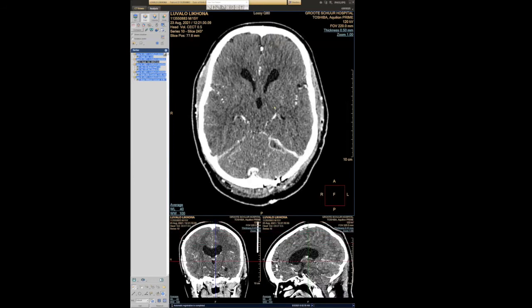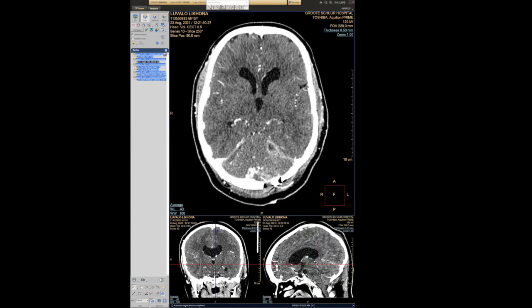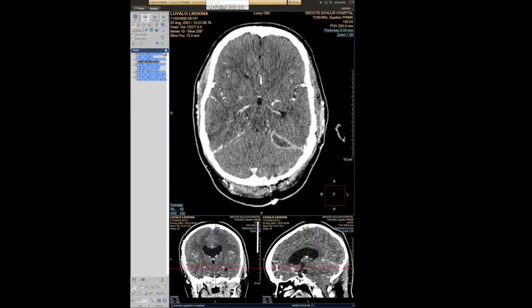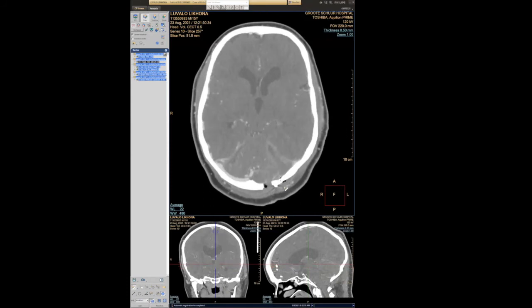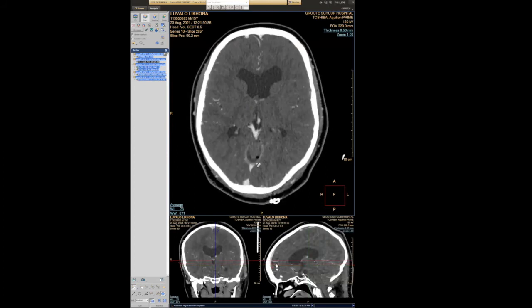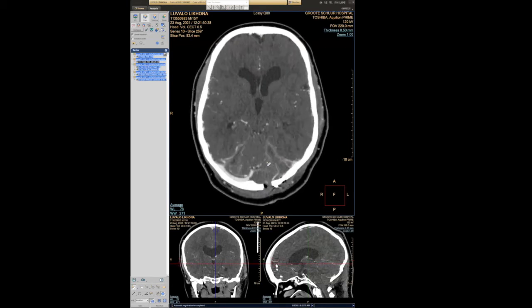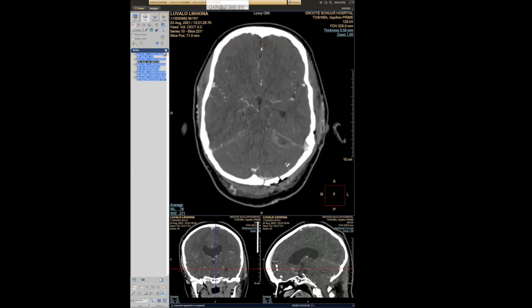The patient then subsequently went for neurosurgical intervention. You can see that there is a left occipital craniotomy with surgical emphysema from the surgery, but just when going down to see the collection, there is no change in size. Well, there is persistence of this subdural collection with the increase in size of this component on the left side.